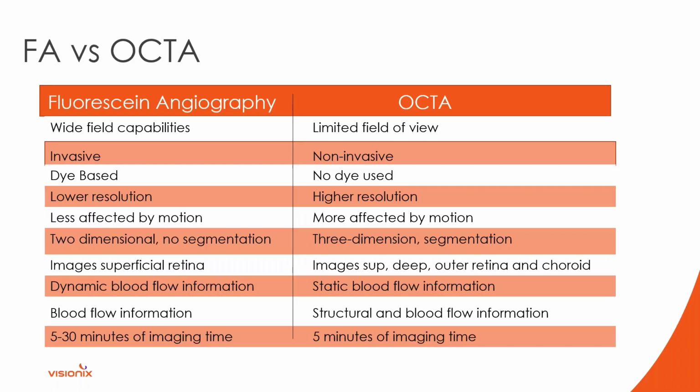When you look at OCTA next to fluorescein, there's a couple of things to keep in mind. They are not the same technology, and each of them has its perks and its downsides. So I'm not going to tell you that OCTA is better than FA, and I'm not going to tell you that FA is better than OCTA. Honestly, each of them has a purpose, and there are still very many times when I do need to send patients out for an FA, and these are some of the reasons here.